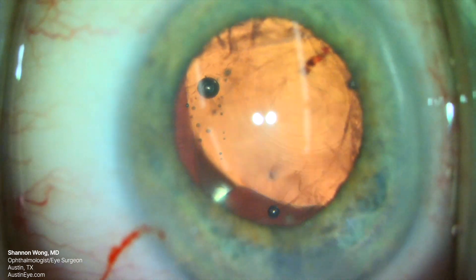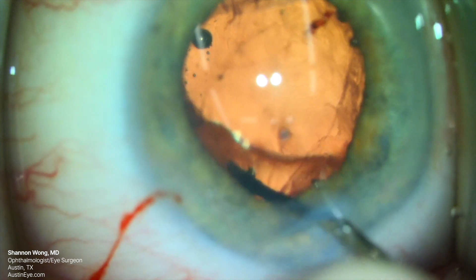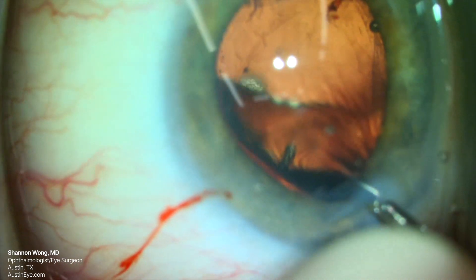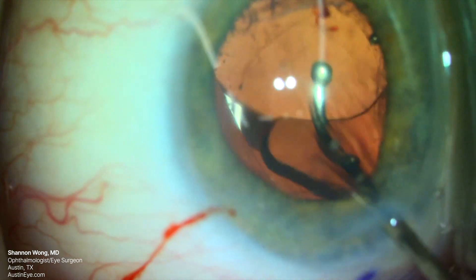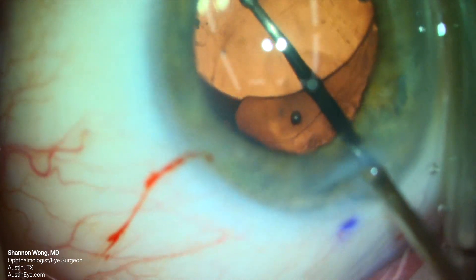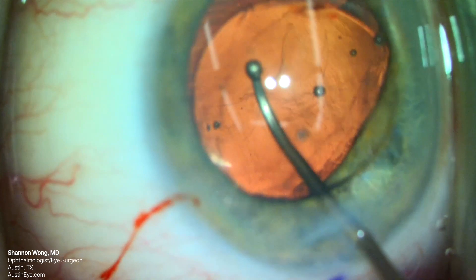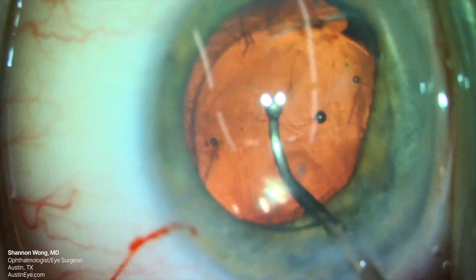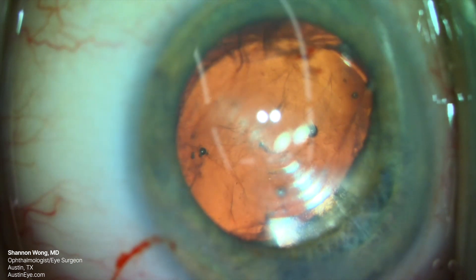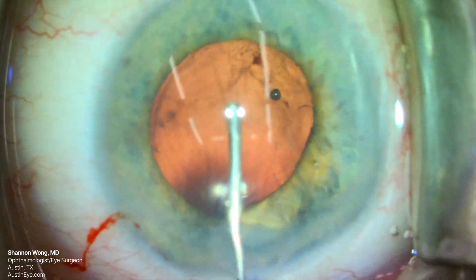I figure at this time that I have one more chance to grab this lens. If I lose this lens into the vitreous and can't lift it, I will have to inform the patient of her situation and refer her to a retina specialist for retrieval of the PanOptix lens. So we use the Conor wand one more time, pass the tip behind the optic, and then gently lift the optic up and back into reversed optic capture configuration.